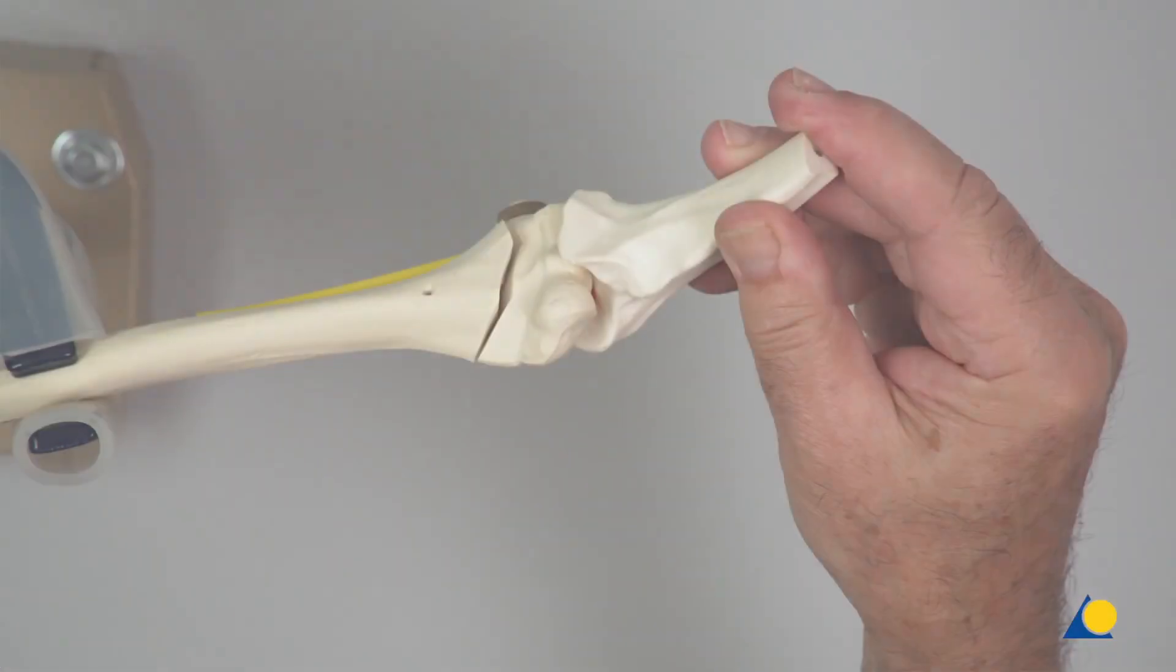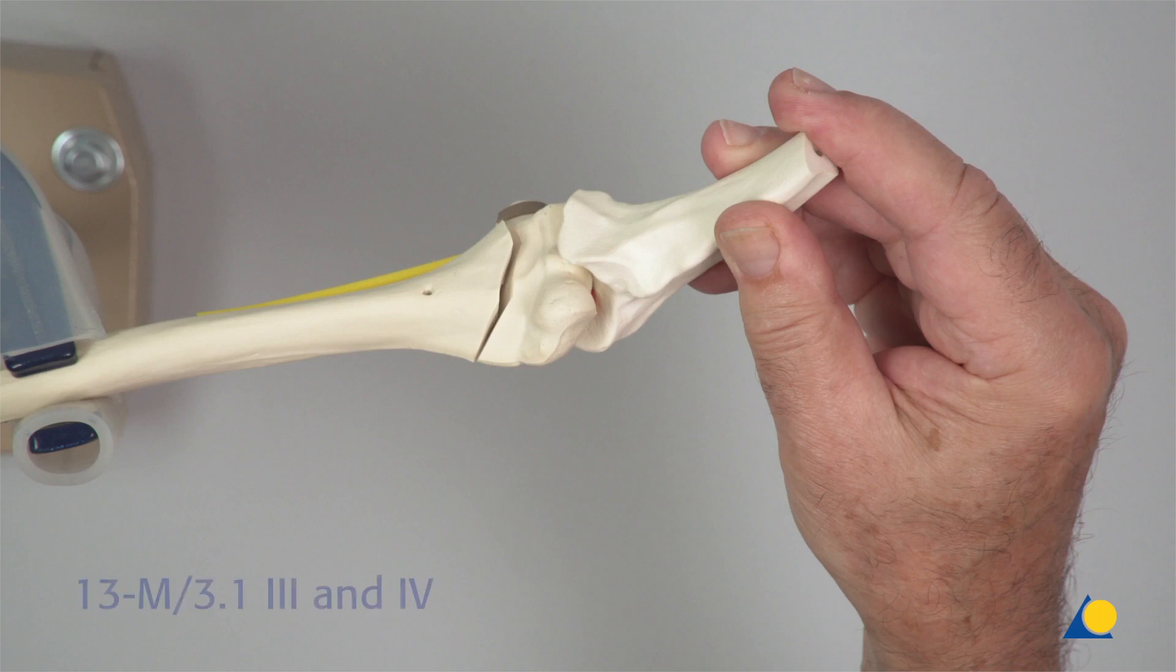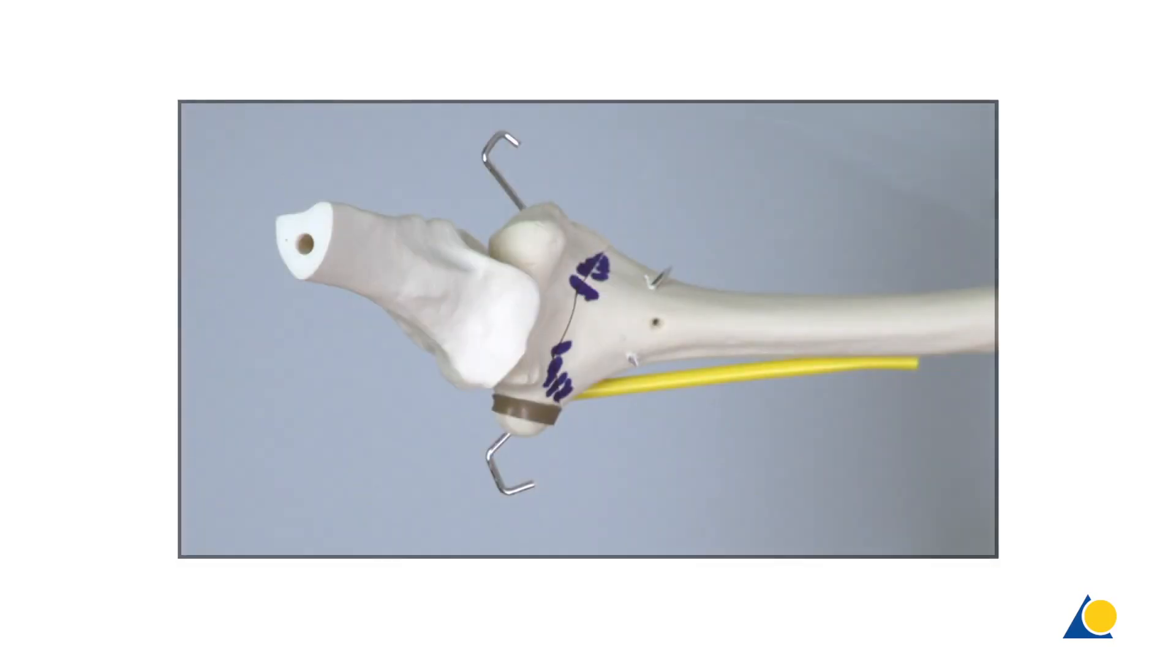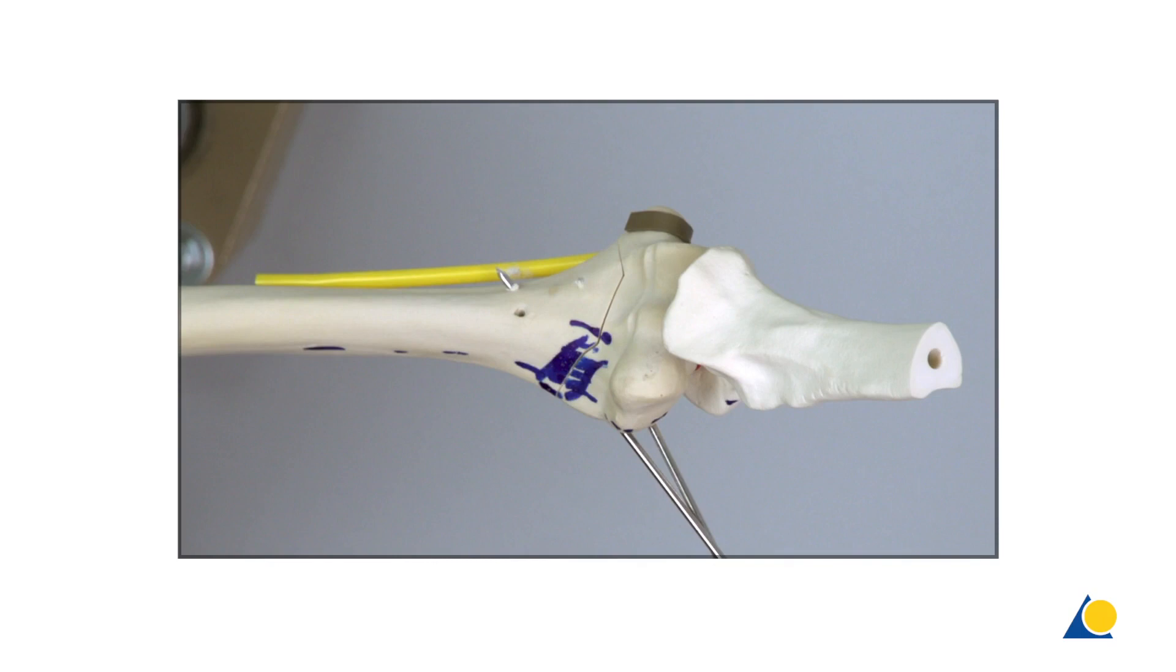In this presentation, K-Wires will be used to demonstrate two fixation techniques for an oblique supracondylar fracture of the distal humerus, AO Classification 1-3-M-3-1, 3 and 4. The techniques are the crossed bilateral 1.6 mm K-Wire fixation technique and the divergent radial 2 mm K-Wire technique.